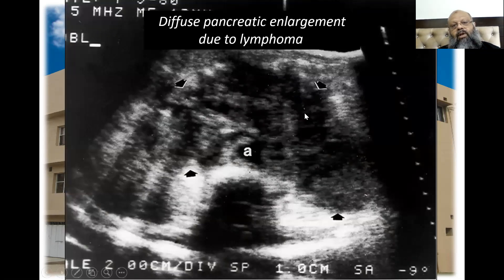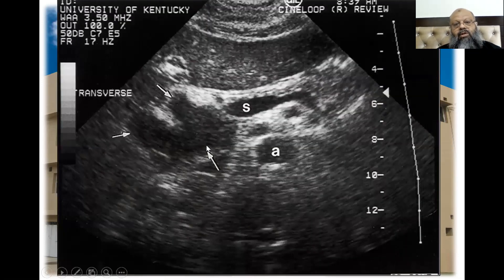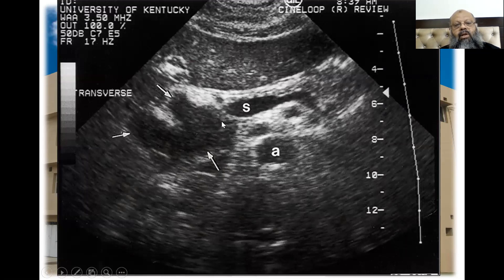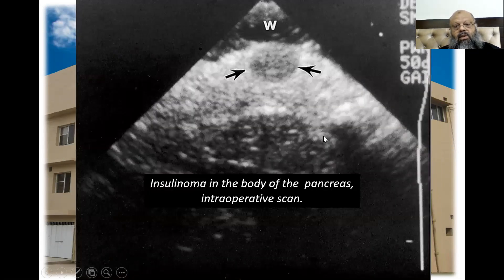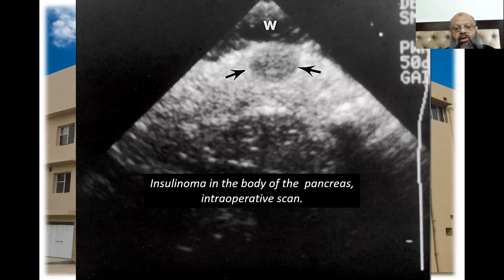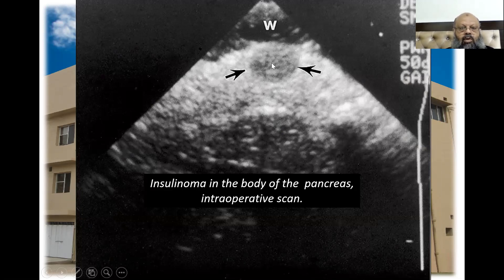A diffuse pancreatic enlargement due to lymphoma — all of this is the enlarged pancreas due to lymphoma. This is another mass at the head of the pancreas, and here you can see an insulinoma in the body of the pancreas — this is an intraoperative scan. So this was something about the pancreas. Thank you for listening.